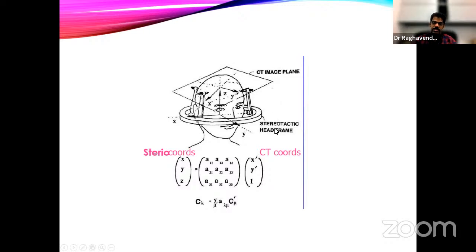If you take this scan of the patient, for every slice you have A11, A12, A13, for different slices, and the same thing from A21, the position of 2, A22, A23, like this. If you put it in a matrix, you have the position of one coordinate with respect to all these N frame coordinates, and that coordinate is a CT coordinate.